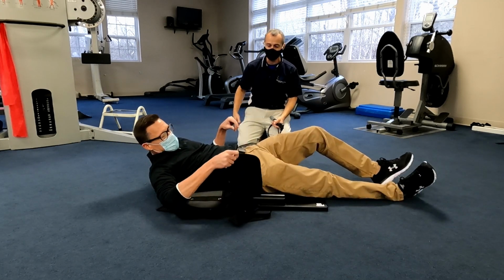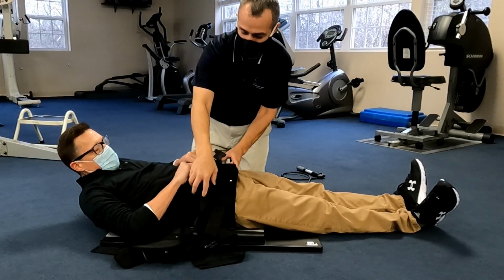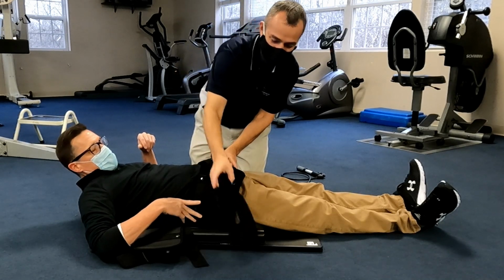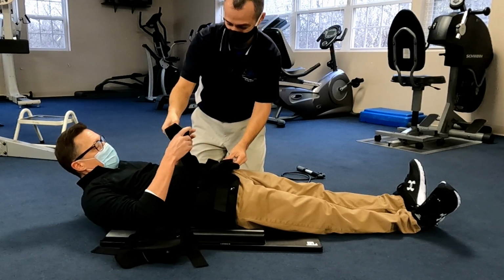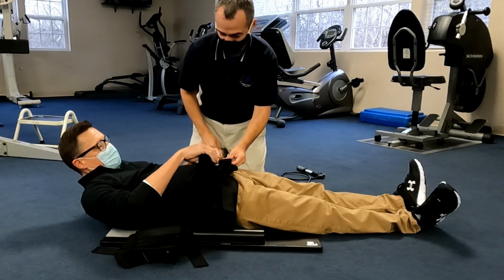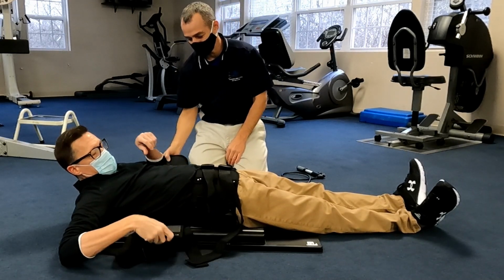Do you have anything in your back pockets, like wallet or anything? Nope. Okay. So we'll bring this across. The way this works is if I lift here, I can create some space. So I'll do these. I'm gonna click it in. You do this one. Perfect. Now just give it a little bit of tension. Perfect. Let's do the upper.